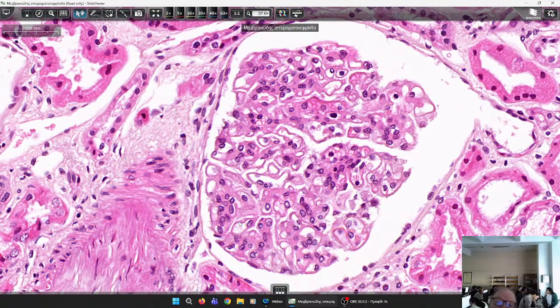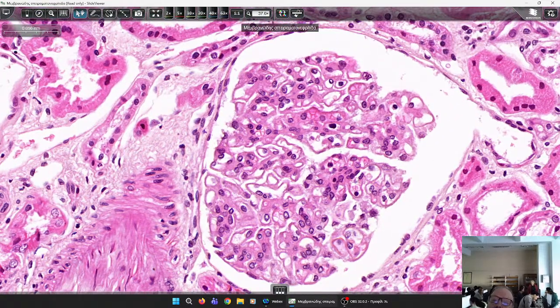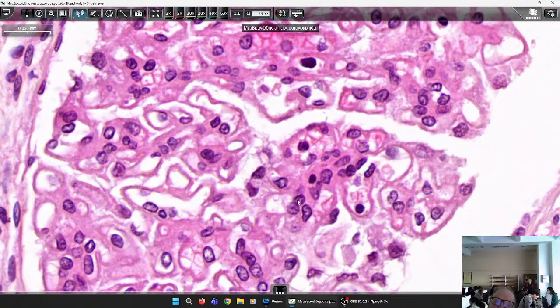As we said, perhaps if you see more than 3 cells in the mesangium, this could be a sign of mesangial hypercellularity. However, this morphological pattern being consistent with another type of immune complex mediated glomerulopathy might, yes? You could think of IgA nephropathy, however, immunofluorescence will be negative for IgA nephropathy. It will be positive for C3 and IgG, in the basement membranes, not in the mesangium.